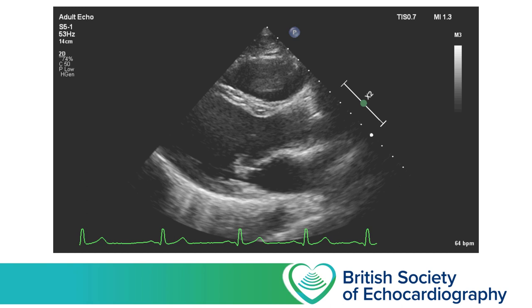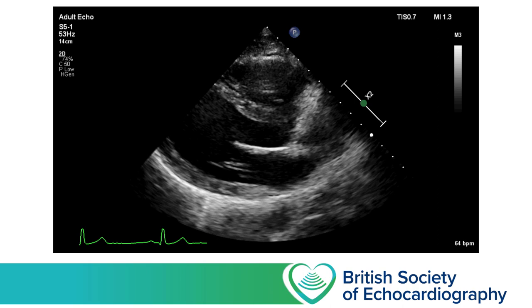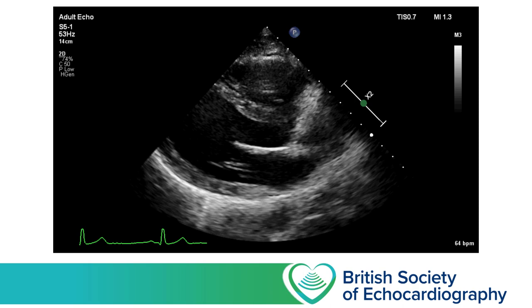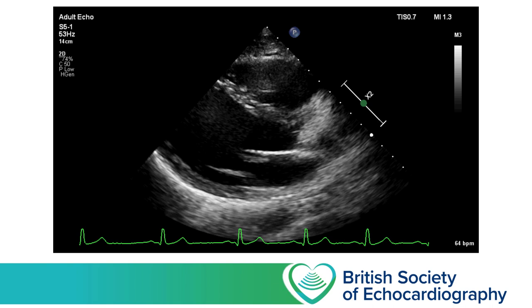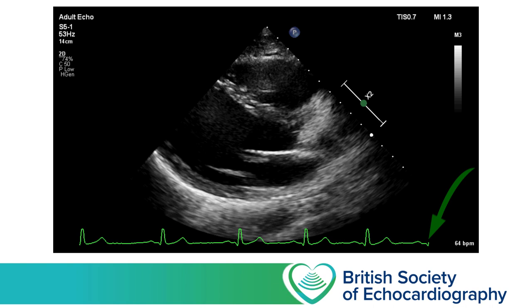Next let's consider the size of the LV cavity. We're going to introduce one of the measurements we should be doing every time for a Level 1 scan: the left ventricle internal diameter at end diastole taken from the parasternal long axis view. We can do this from a frozen 2D clip or, if the alignment allows, from an M-mode image. Here we have our PLAX view, and we freeze the image and scroll through to end diastole — the same frame we'd use to measure LV wall thickness. We're at the onset of systole, so the ECG marker is around the upstroke of the R wave.